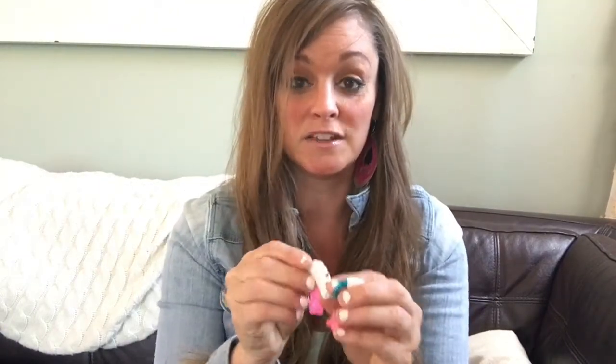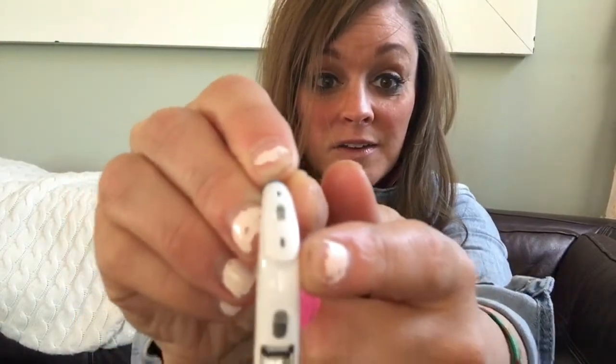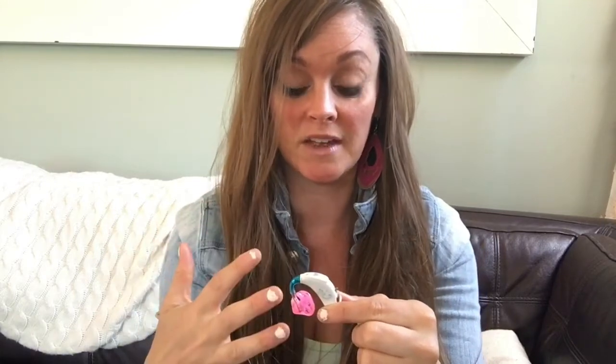So there are three things that a hearing aid does. It has a microphone that takes in the sound from outside — here's my daughter's hearing aid, and you can see the microphone up here. It then goes through electronic signals — I'm no audiologist, just a mom with two kids with hearing aids — and it amplifies the sound to a speaker that puts the sound into their ears so that they can hear sound more clearly, not just louder. That's the awesome part of hearing aids.